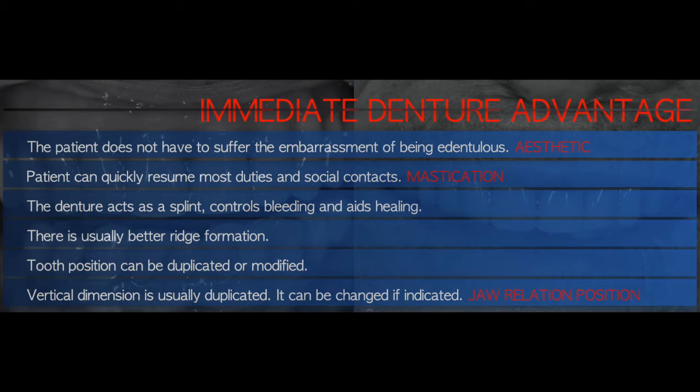And there's usually better ridge formation when you deliver the prosthesis on the same day.